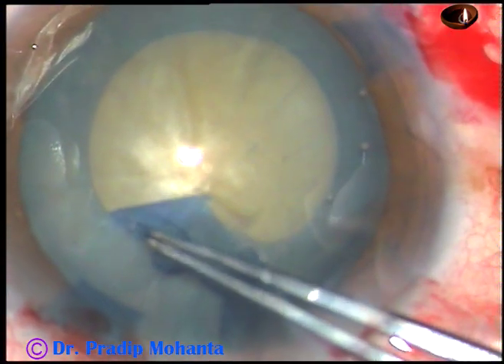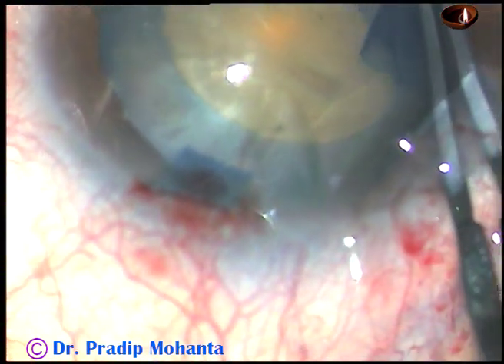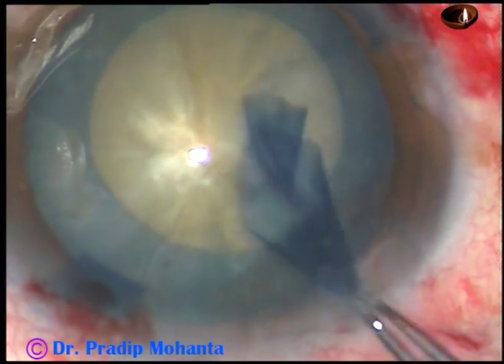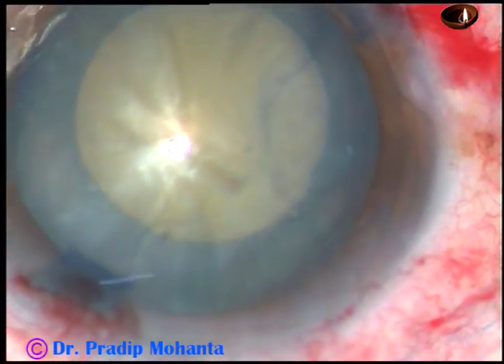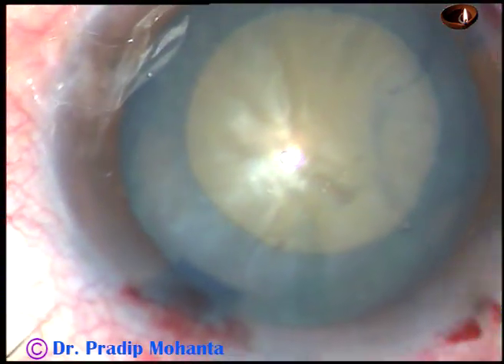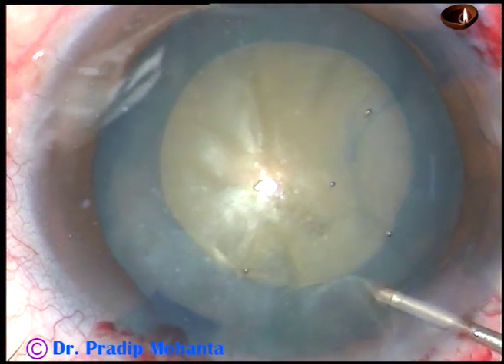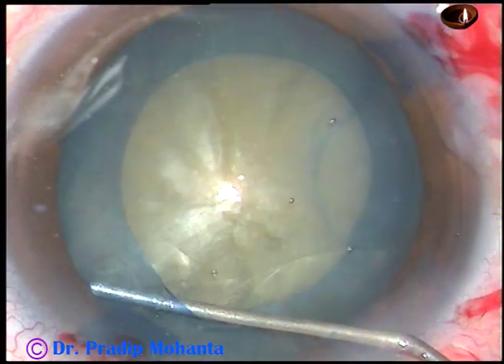Because there is some convexity of the anterior surface of the lens, if I try to do a large rhexis and it goes to the periphery, I may not be able to retrieve it. But if I aim for a rhexis of about 5 millimeters, even if it goes to the periphery, I will have some safety margin to retrieve the rhexis.